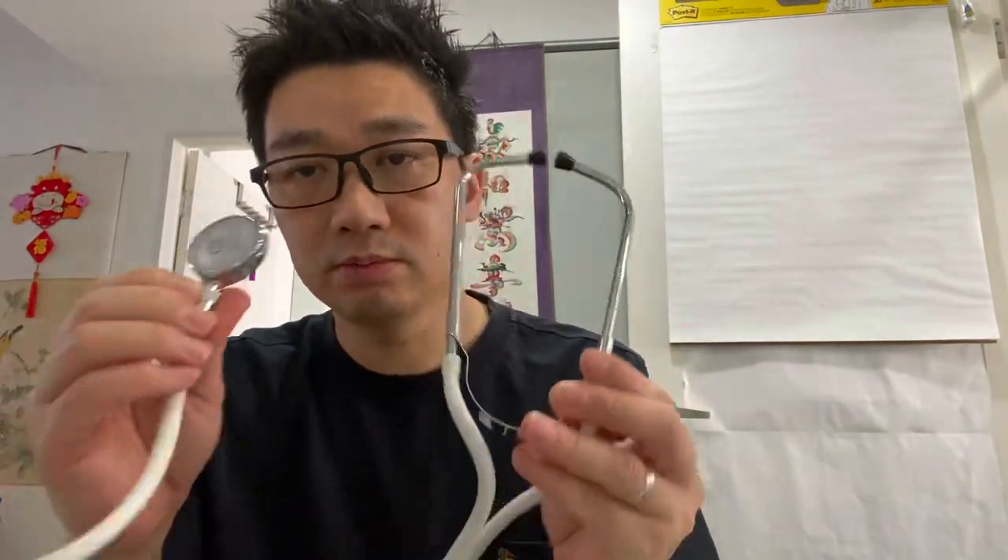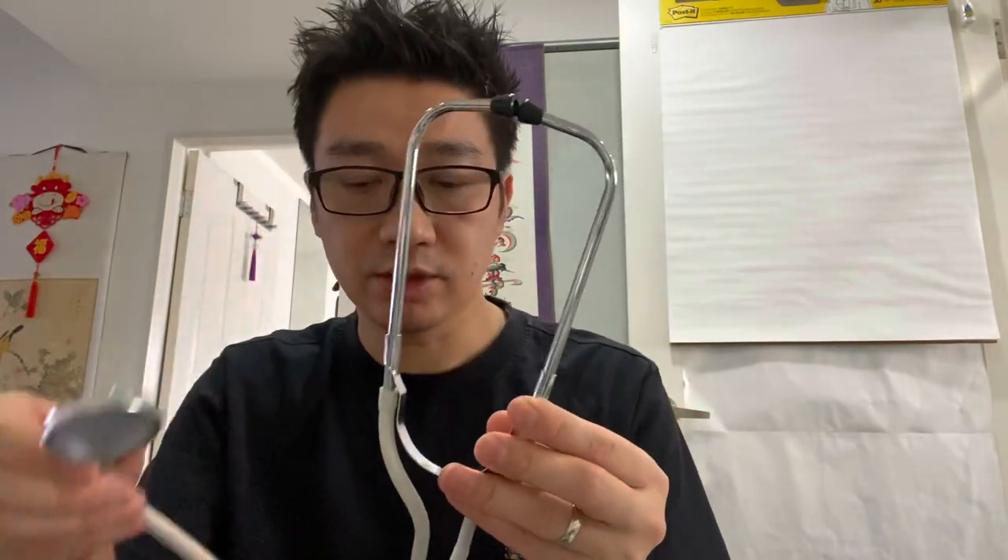So what's it used for? Well, this is your traditional stethoscope. You just put it in your ear and you can listen to things - your heart or whatever. The only problem is that only you can hear it. By going digital, you can potentially record things.